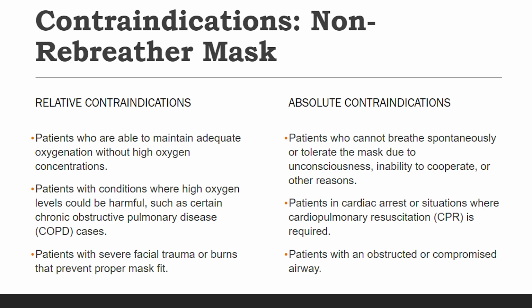Now, for its absolute contraindications. In absolute terms, the non-rebreather mask should not be used for patients who cannot breathe spontaneously or tolerate the mask. This includes unconscious individuals, those unable to cooperate, or those with specific medical reasons prohibiting mask use.